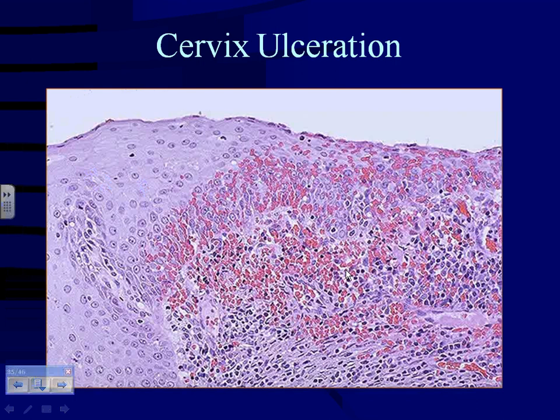But over here in the stroma, you've got all these inflammatory cells that look predominantly to be chronic, looks like lymphocytes predominantly. And then you've got all this blood, okay? And you've got extravasated blood, both in the underlying stroma as well as in the epithelium. And the reason that occurred is because notice this epithelium over here is normal looking, and over here it's very thin.